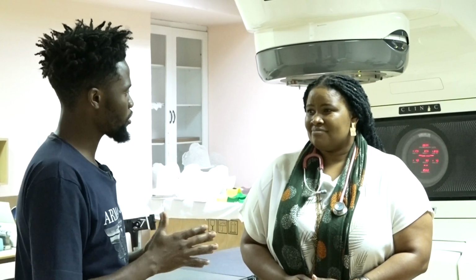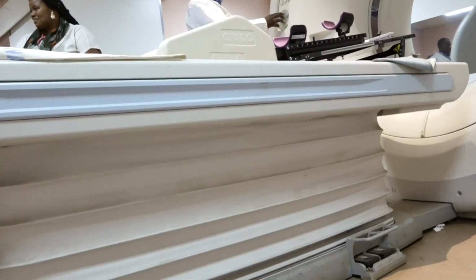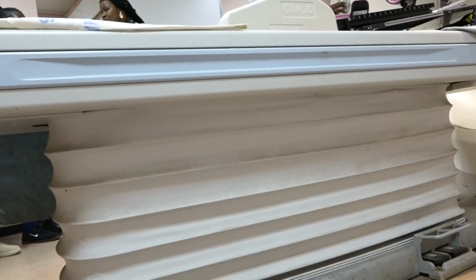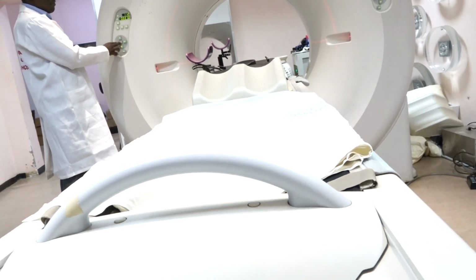All right, that's beautiful. So could you kindly explain to us how we go through the whole process of treating with radiotherapy? Okay, so radiotherapy is a process. If a patient is coming for radiotherapy, firstly, we want them to prepare for this session depending on what region of the body we are treating. When we are giving radiotherapy, we target a particular region of the body which is affected by the cancer. Before the actual treatment, they go through what is called simulation. This is a process where we take images whilst the patient is in their treatment position.